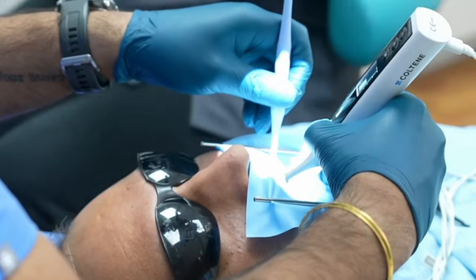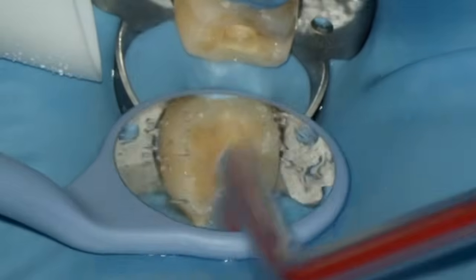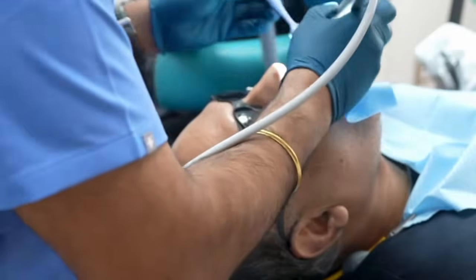The challenges of this case, looking at it to begin with, is that the roots themselves are very long and thin. There are calcifications present or suggested on the radiograph, and there may be curvatures that we find. I hope you find this case interesting, and let's see how it goes.